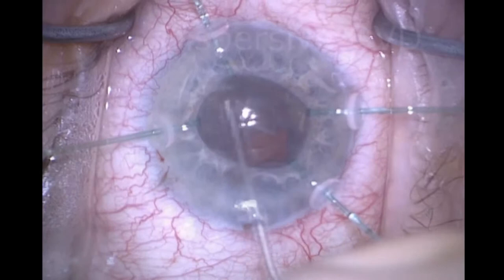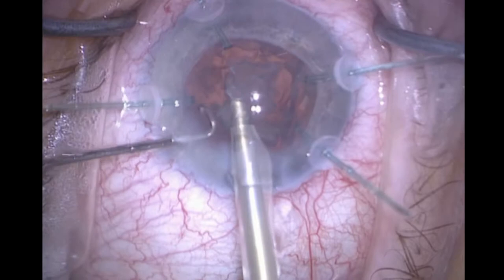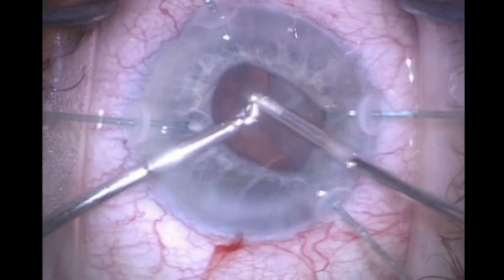As we get toward the last fragment, or the epinucleus, I refill the capsular bag with a dispersive viscoelastic so that it won't be aspirated into the phaco tip. Why is that? You don't have the normal centrifugal zonular tension keeping it taut, and so it wants to follow the cortex right into the I/A tip.